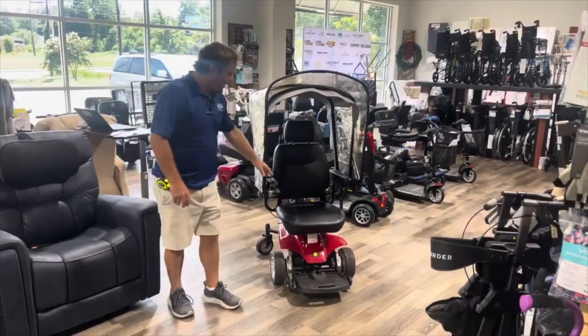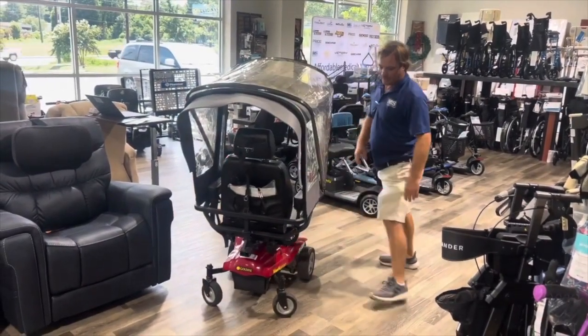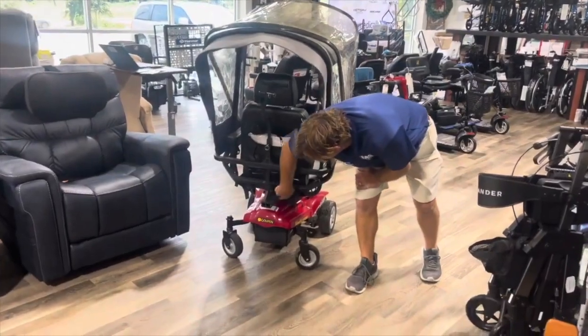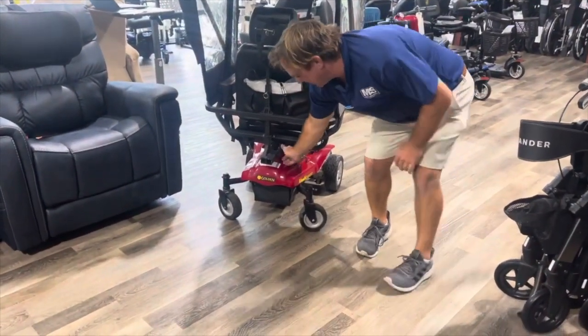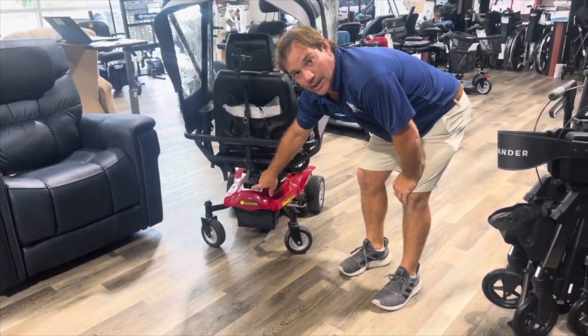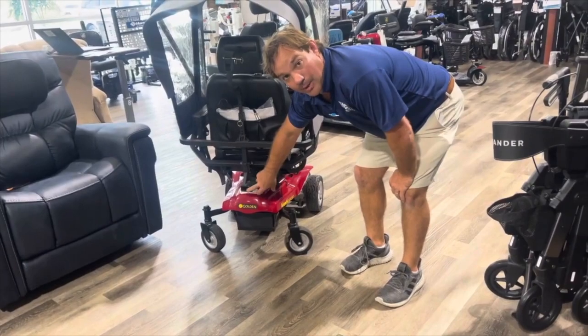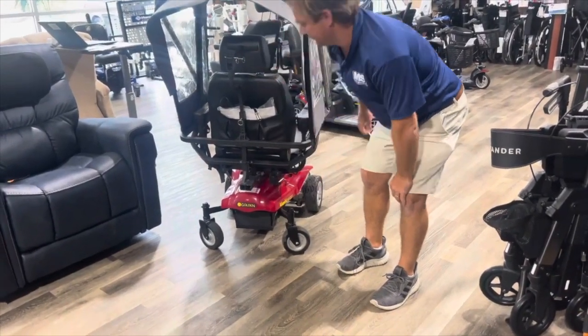You're ready to go. All it does is it plugs right into your receiver port at the back, and you can take it right off really fast. Here's an extra port for an oxygen tank holder, cane holder, whatever you need back there. Basket could go right into here.